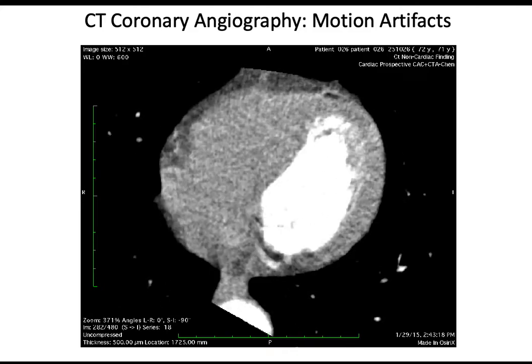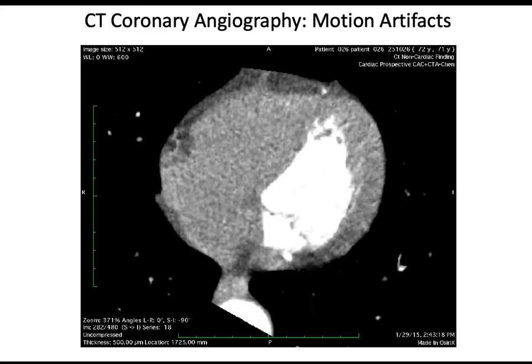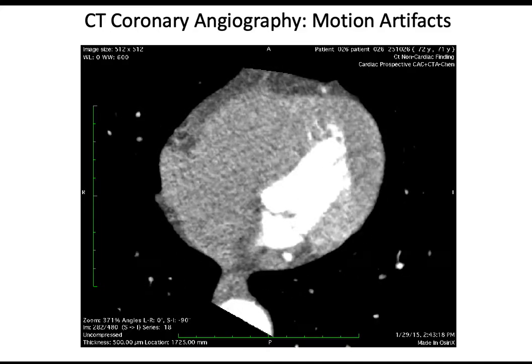This is because you're capturing a motion. You can see that it contracts, then there's an atrial kick, and it moves this way, and then it contracts again. You can see it bounce to the bottom, and then go up and back. When it's moving at a high velocity, it creates these arcs. If that were the only picture you had, you can't really tell if it's open or closed.